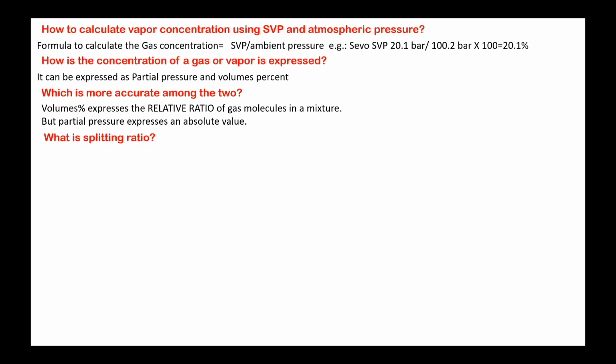So the fresh gas flow, whatever is coming from the flow meter, is called the fresh gas flow, because it is fresh, it does not have anything other than what you have proportionately kept in the flow meter. Now when you keep 1 liter of oxygen and 1 liter of air, you get a total of 2 liters coming out per minute.